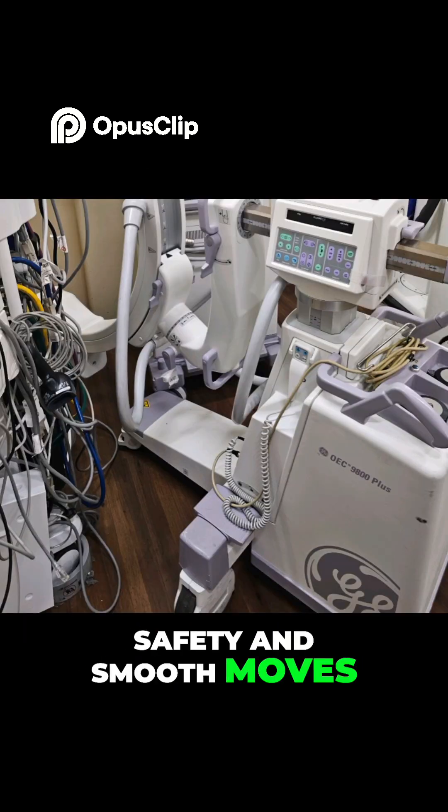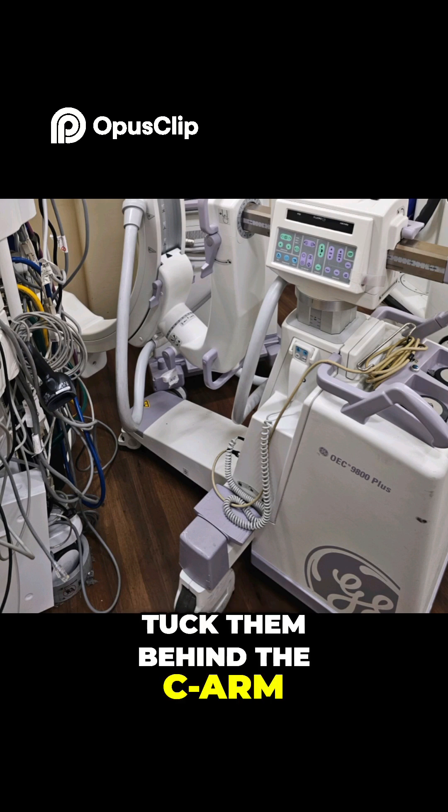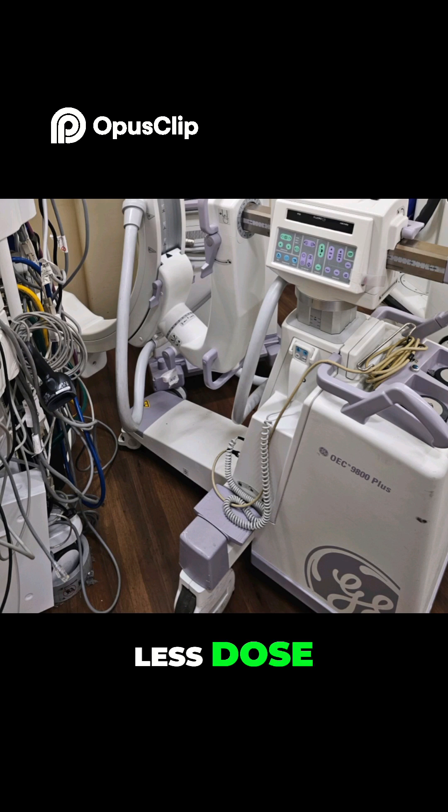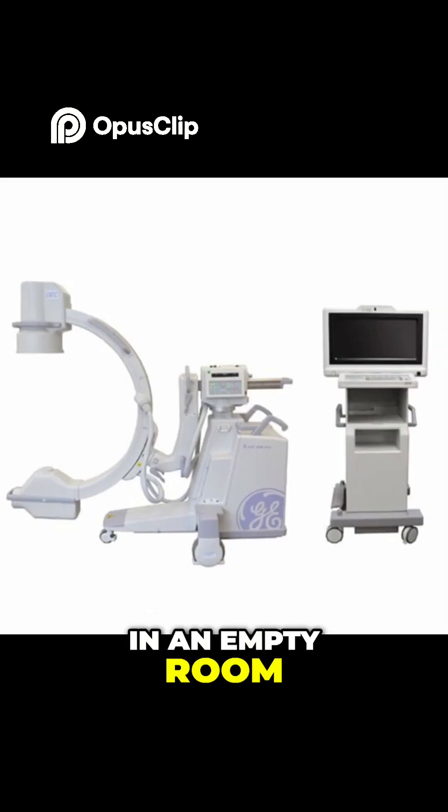Tip 7: Safety and smooth moves. Tuck cords behind the C-arm — no tripping. Raise the table if needed for better images and less dose. Practice driving the C-arm in an empty room.